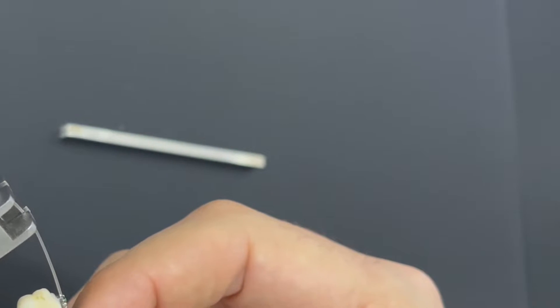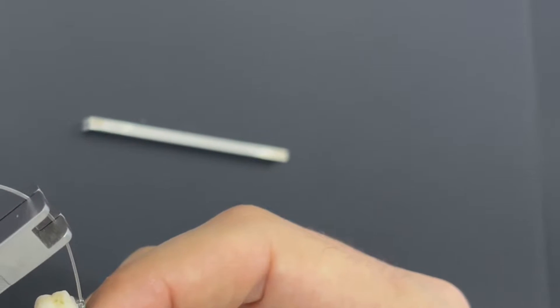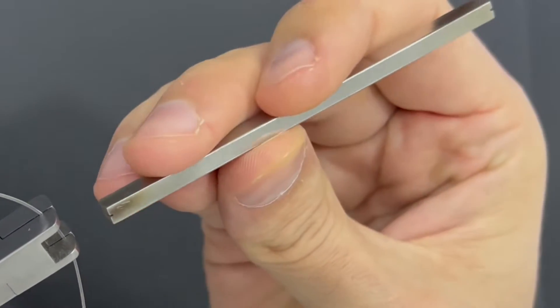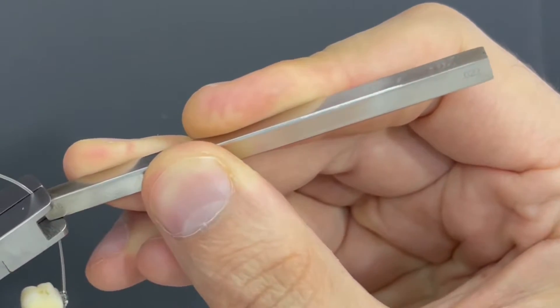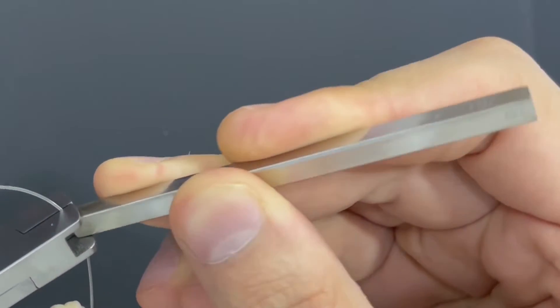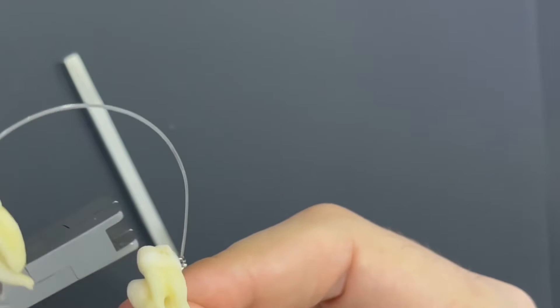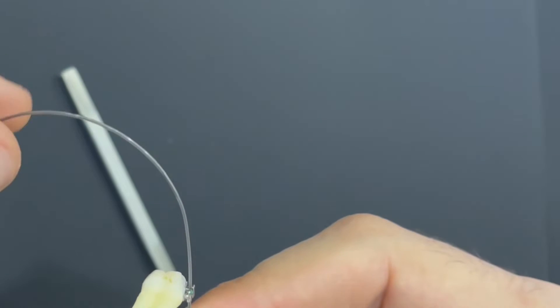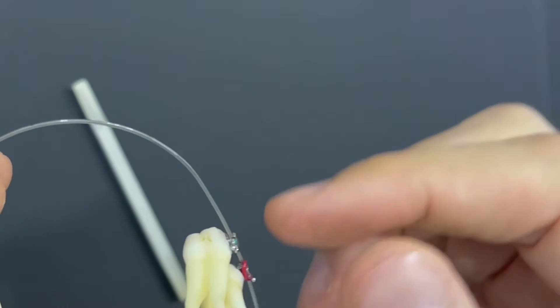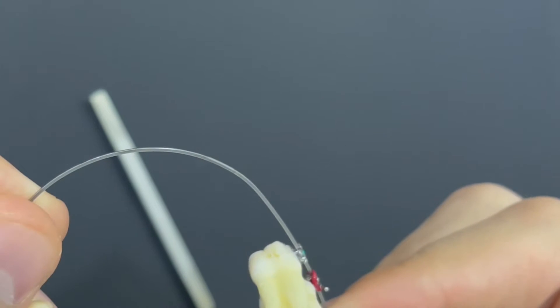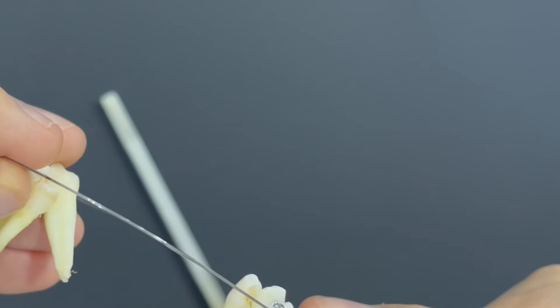Depending on the wire size, we can change the angle more or less. For example, with 16x22 stainless steel wire we can increase the angle, but with 19x25 it's not possible to make as big an angle as with 16x22.